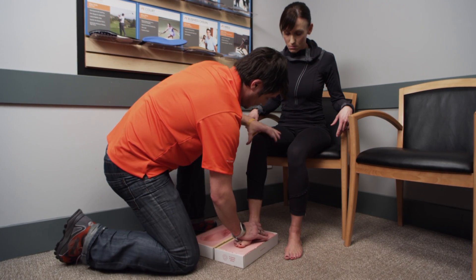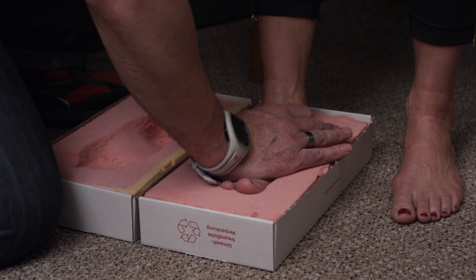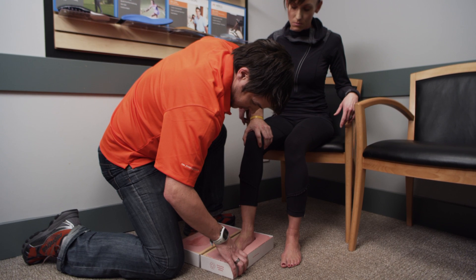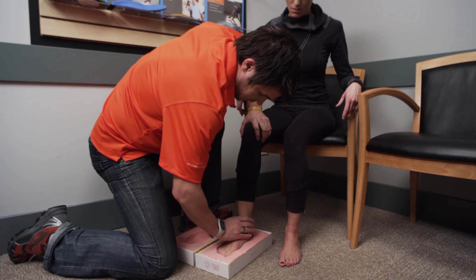Unlike over-the-counter insoles, a custom made foot orthotic requires a prescription from a doctor and is made specifically for the patient following an assessment of their feet and legs by a foot care expert such as a Canadian certified pedorthist.